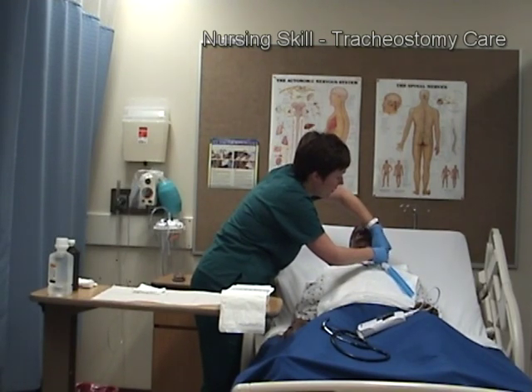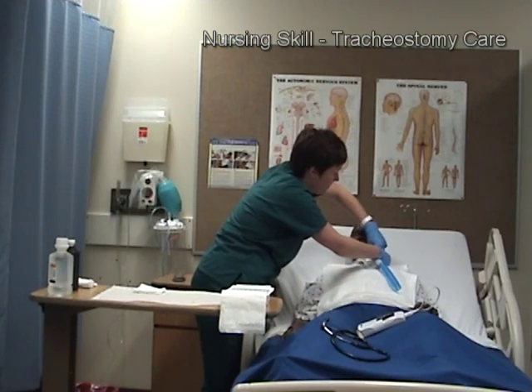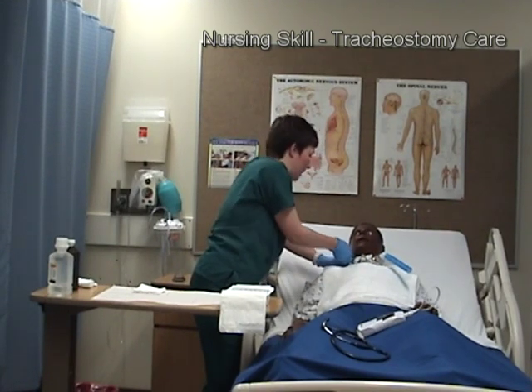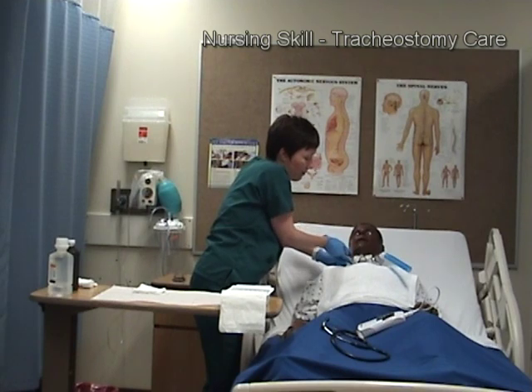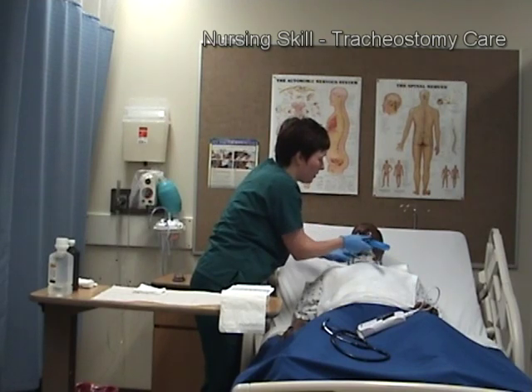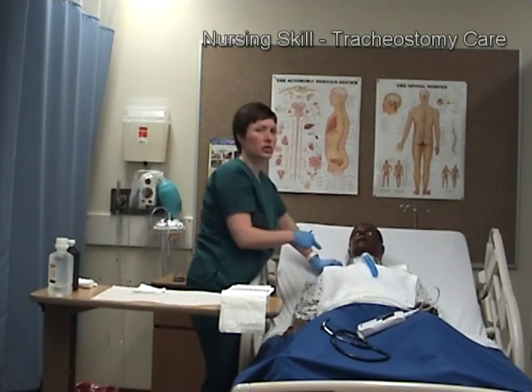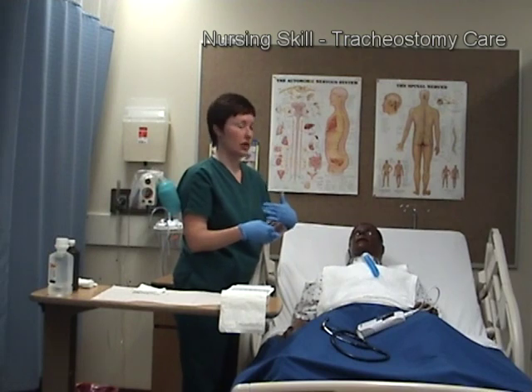I'm using tweezers from the kit as well as my fingers to place the drape. I want to make sure the drape is as smooth as possible, since the gauze can catch on the Velcro of the neck strap. I'll also assess the neck strap — making sure I can fit two fingers underneath it and checking for any irritation or skin breakdown — using this as an opportunity to both complete the task and assess the patient.